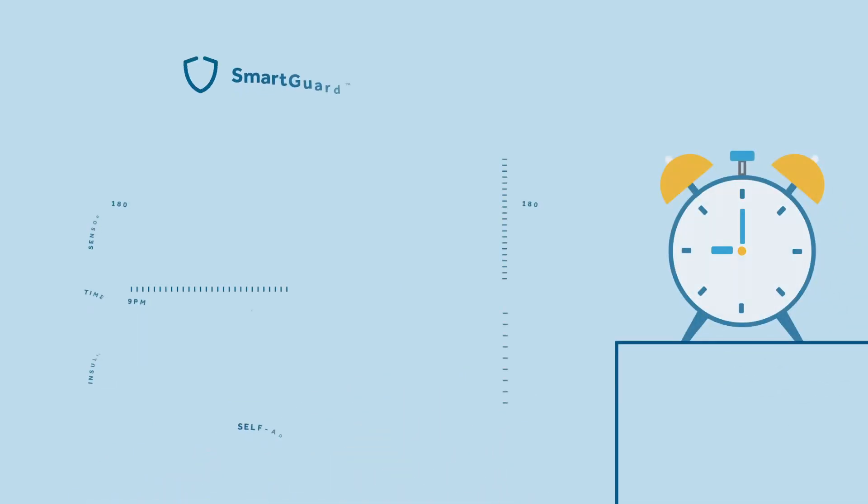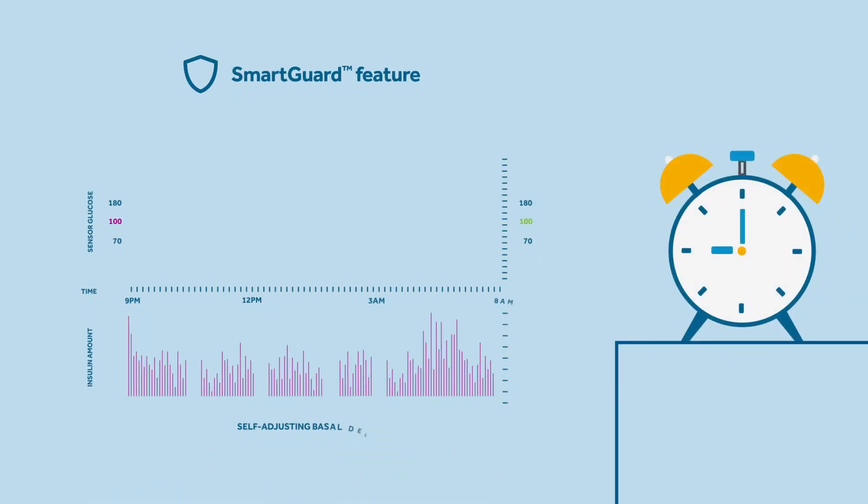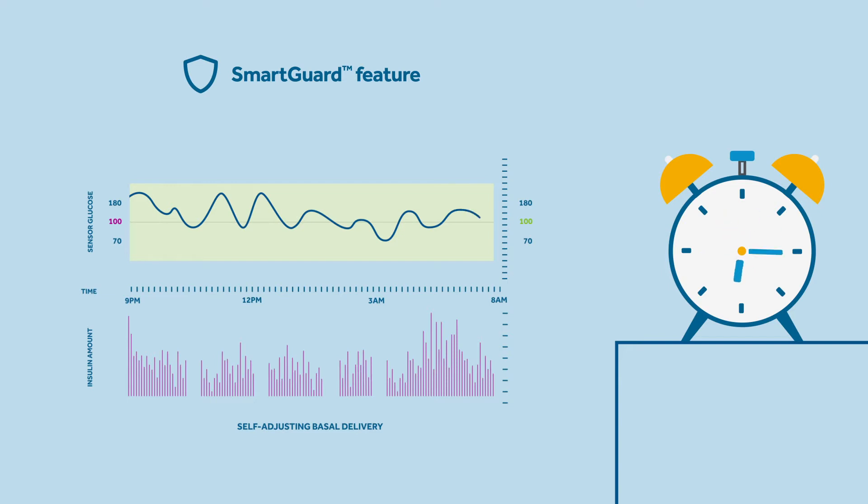Sophie learns that this is because the SmartGuard feature provides automatic basal adjustments, known as autobasal, every five minutes, and autocorrection boluses if needed. These adjustments are based on Sophie's glucose values and trends, with a default target of 100 mg per deciliter, but a target of 110 or 120 mg per deciliter can also be selected. The target value would have been chosen together with her healthcare professional to support the goal of the lowest risk of hypos while keeping the greatest time in range.